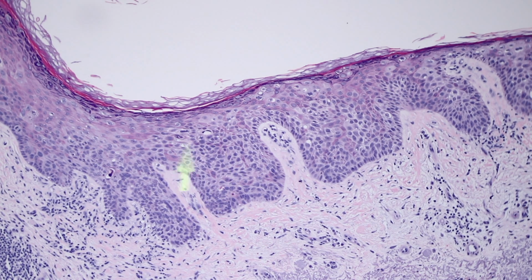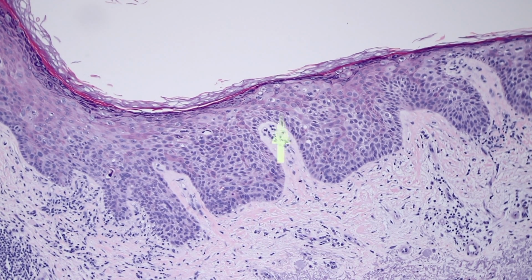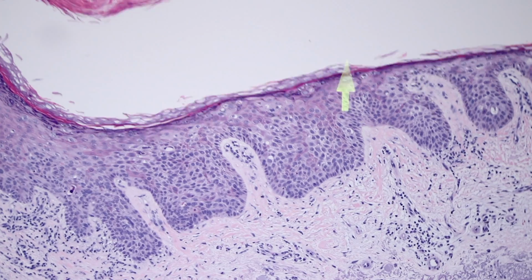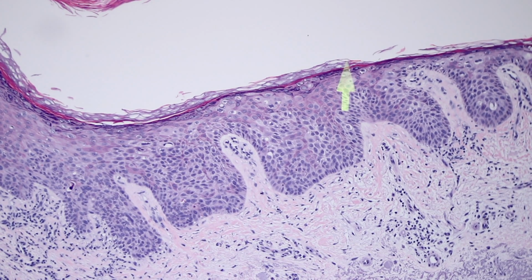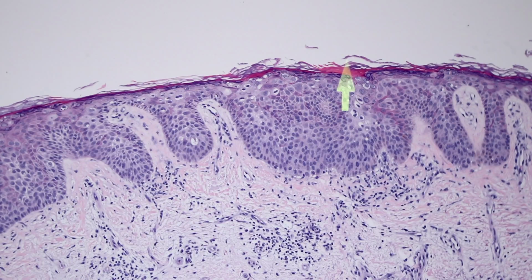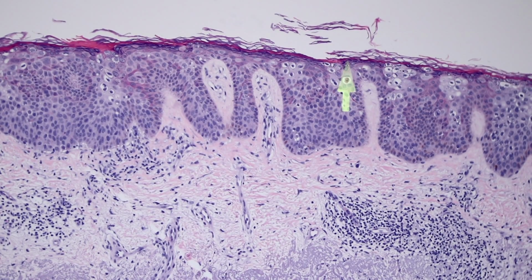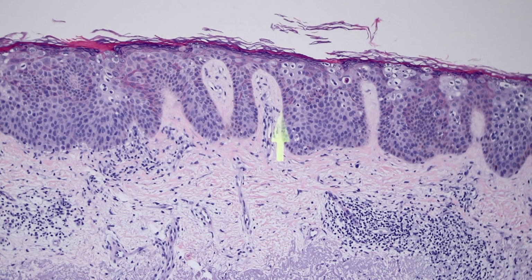And so you might argue, well, look, it's not full thickness. There's a tiny layer of maturation there. When I see this much atypia that's this cellular and there's pagetoid spread, I call that squamous in situ, even if it doesn't have full thickness atypia. That's the way I do it. If I start seeing pagetoid spread in something that looks like an AK, that tends to be a thing that pushes me over into calling something squamous cell carcinoma in situ. And again, there's some more of that kind of eyeliner sign right underneath.